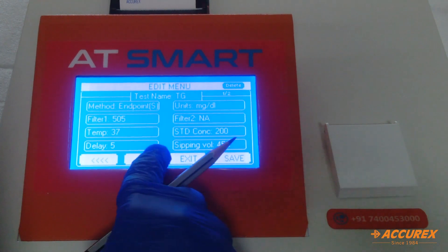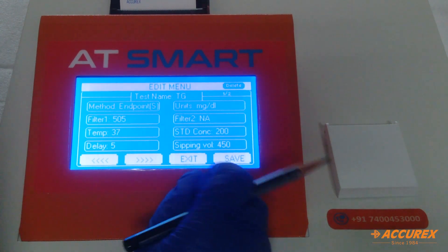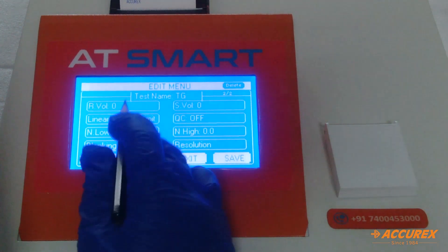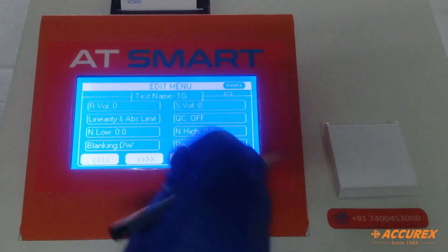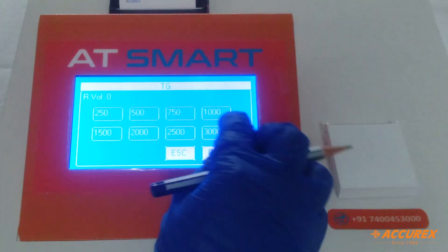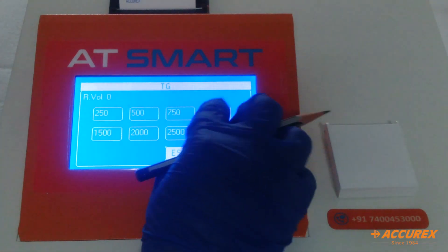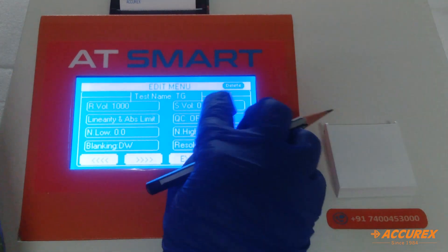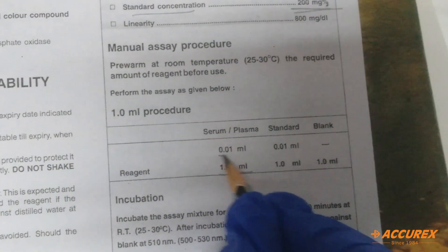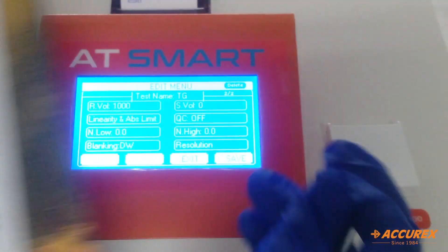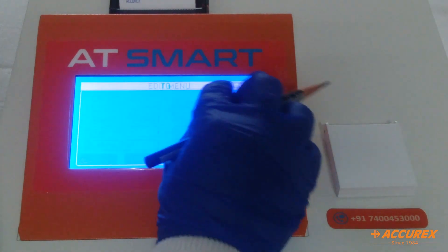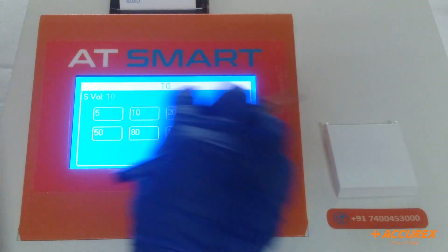Now go to the next page. For reagent volume, it is 1 mL, so press 1000 microliters and enter. For sample volume, it is 10 microliters, so press 10 and enter.